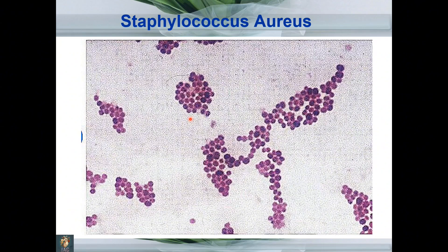This is a very common and important slide showing a gram-positive bacterium — gram positivity shown by purple color. You can appreciate a round shape, meaning these are cocci. Looking at the arrangement, these cocci are arranged in irregular clusters with a grape-like cluster appearance. Whenever you see gram-positive cocci in clusters, your diagnosis is Staphylococcus aureus.